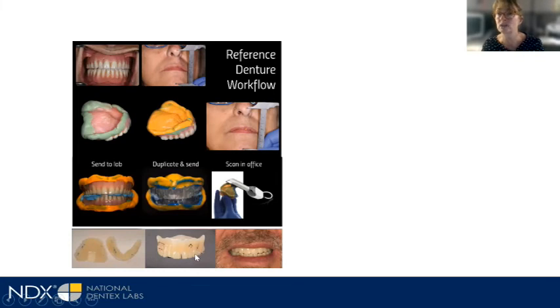The patient could actually leave with that try-in and test it out. You can make modifications to the try-in, to the bite. You could rotate a lateral or shift to your midline. You could do lots of things with the functional try-in.